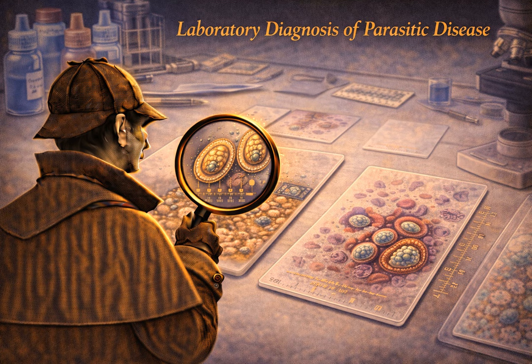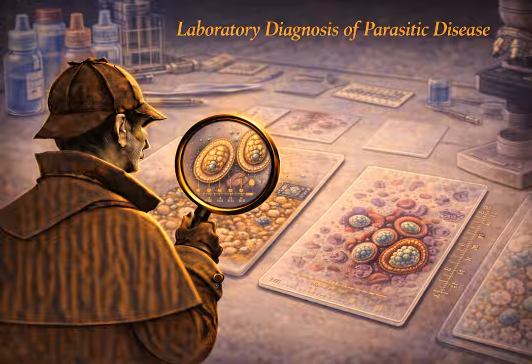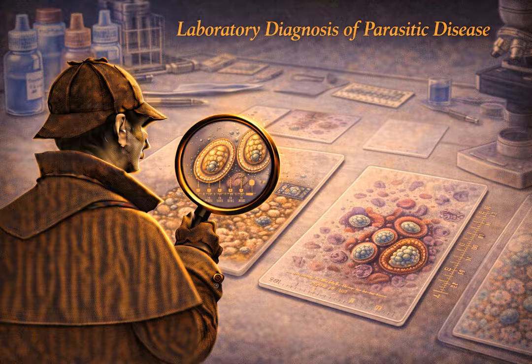Step 1 is the direct wet mount. You take a tiny, tiny bit of the fresh stool, you mix it with a drop of physiological saline on a glass slide, put a cover slip over it, and you look. And what is the primary target for step 1? Motility. This is the one and only step in the entire process where you can actually see the organism moving around. You are scanning for the tumbling, erratic movement of Giardia, or the purposeful directional swimming of Entamoeba trophozoites, or the active wriggling of those Strongyloides larvae we talked about.